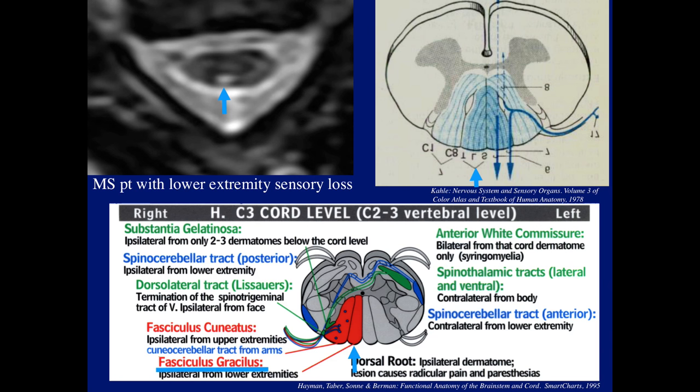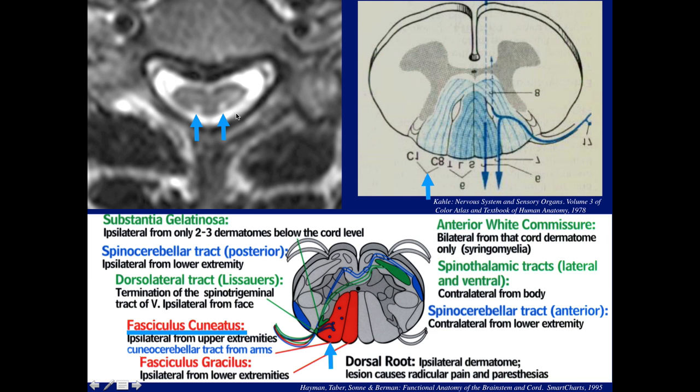The two gracile fasciculi are more medially and the cuneate more laterally. What are we seeing in this case? Stefan answered correctly: we're seeing abnormality involving the cuneate — notice they're more away from the midline. The arrows are pointing to the cuneate on this side and on the opposite side — both cuneates involved.